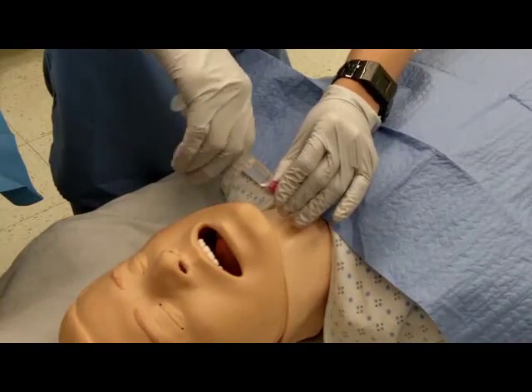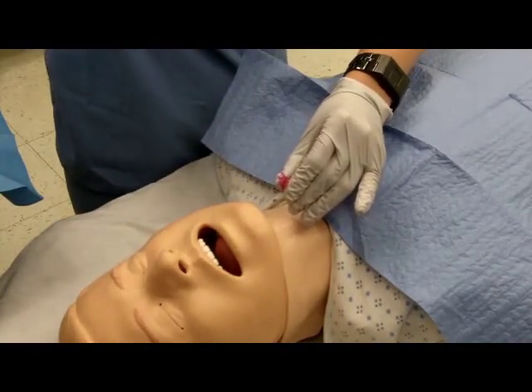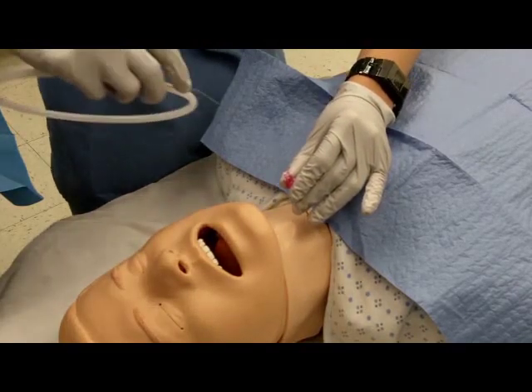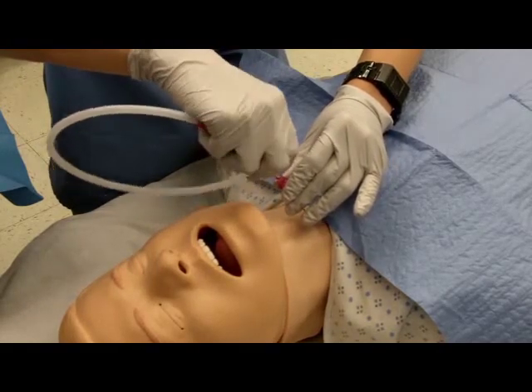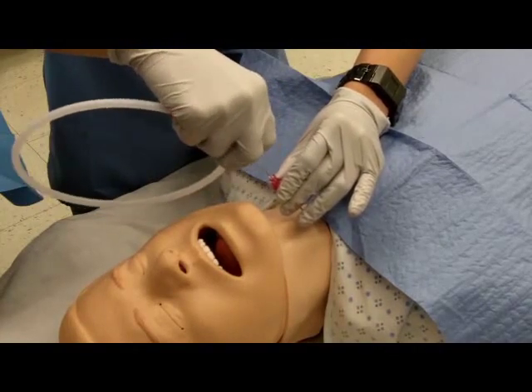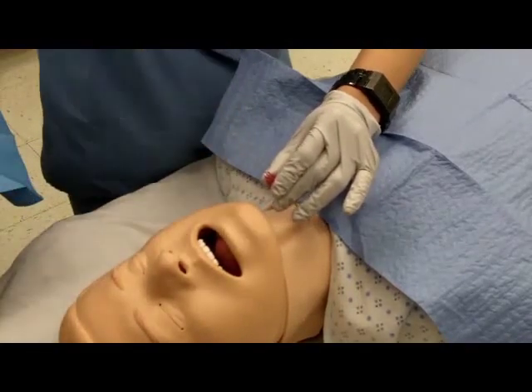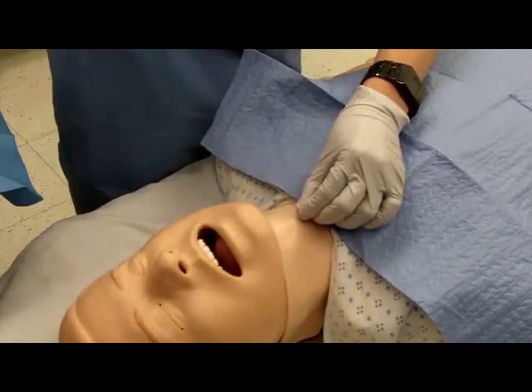When bubbles are seen in the syringe, remove the syringe, leaving the needle in the trachea. Thread the guide wire through the needle and into the trachea. Remove the needle, sliding it over the guide wire.